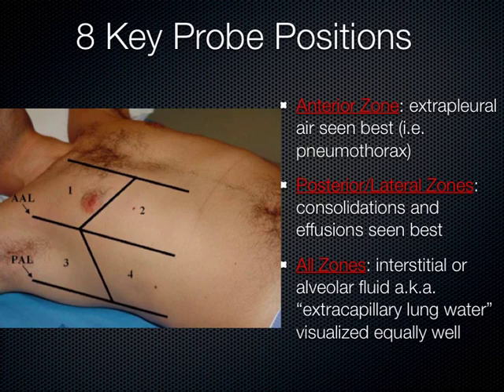It's going to be anterior, right? And posterior laterally, we can best see effusions, which is fluid that's in the pleural space, and consolidations, which are pneumonias or atelectasis of the lung, posteriorly, because those are gravity dependent. In all zones, though, you can appreciate pulmonary edema.